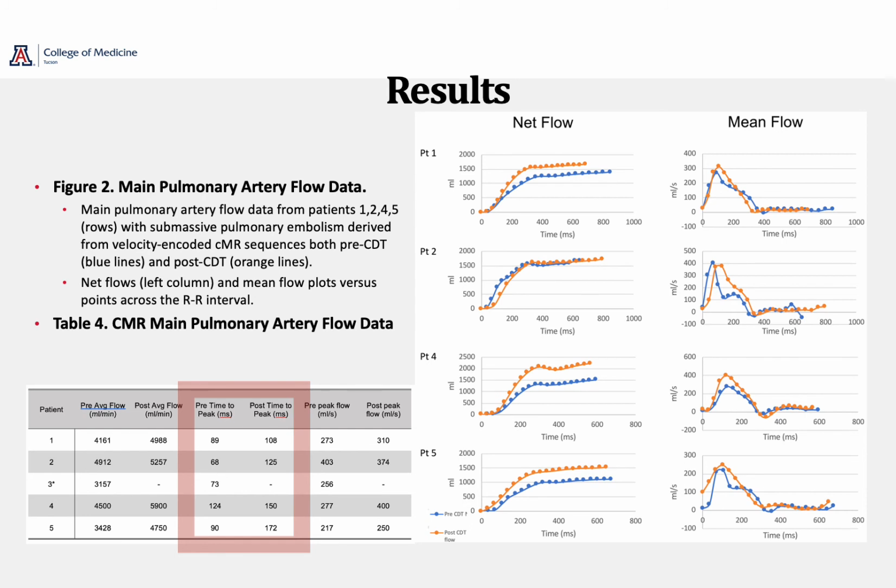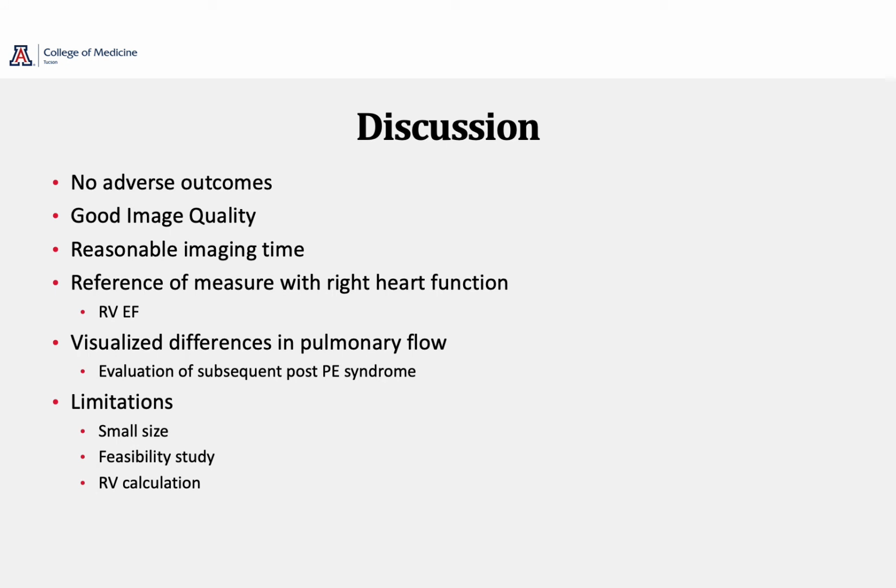And of note, after catheter-directed therapy, virtually all of our patients had an increased time to peak. And so that development of RV pulmonary hypertension seemed to dissipate. And so in discussing the study, we had no adverse outcomes.